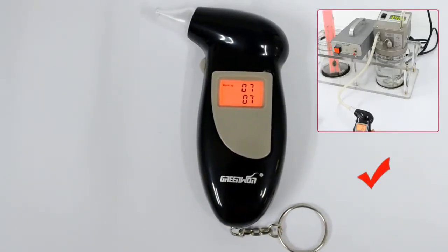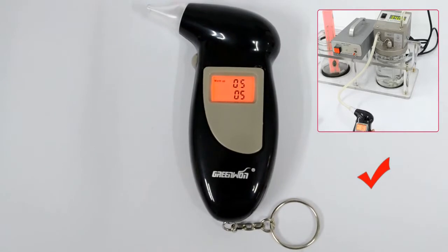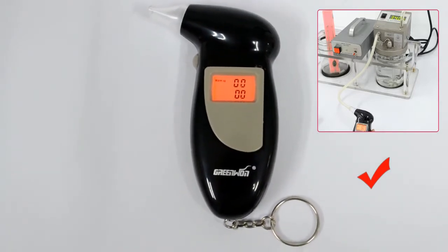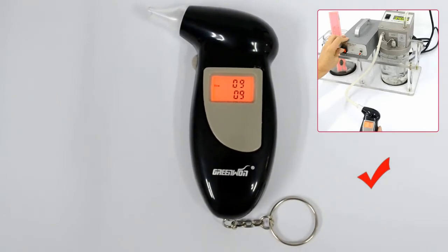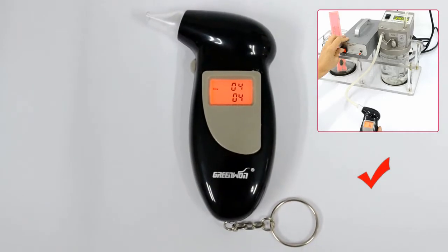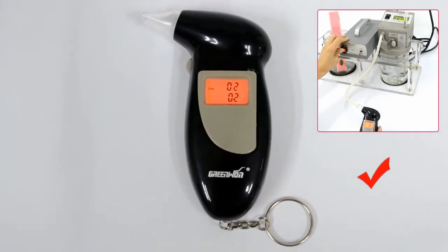When warm-up counts down from 10 to 0, please do not make your testing during this time. When blow count down from 10 to 0, please make your testing during this time. Do not test when the display is showing flow.